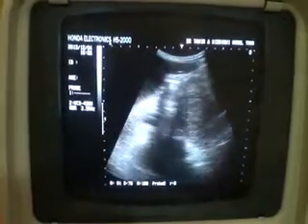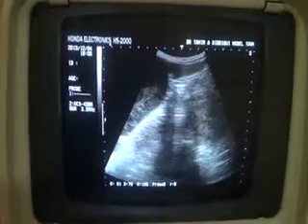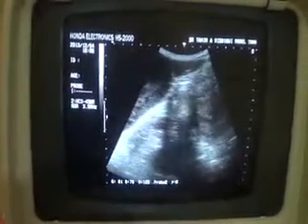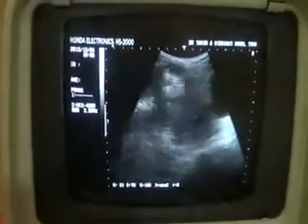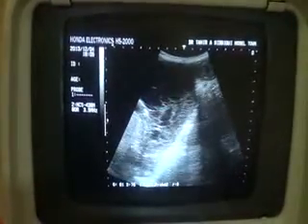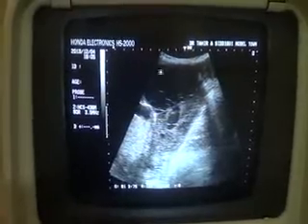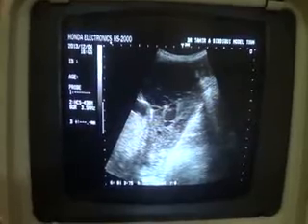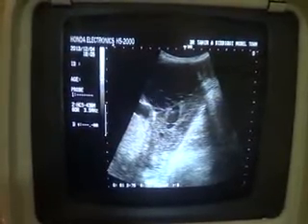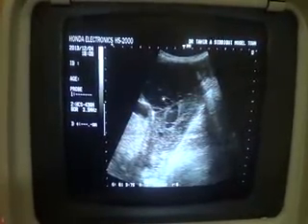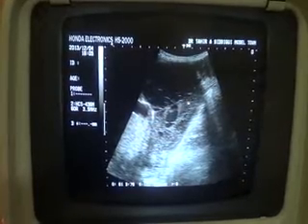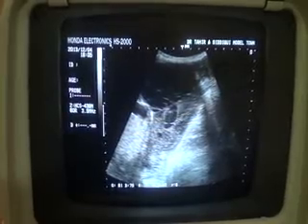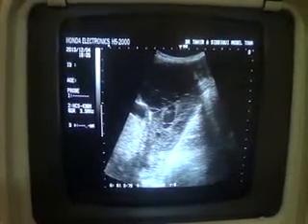This is the uterus again in longitudinal section. When I move the probe towards the right side in the region of the right adnexa, I see a large mass. This is the mass. This is fluid within the mass. This is the solid element within the mass. These are the septa — thick septa, thin septa, some incomplete, some complete. A complex cystic and solid mass with fluid and septation is seen.